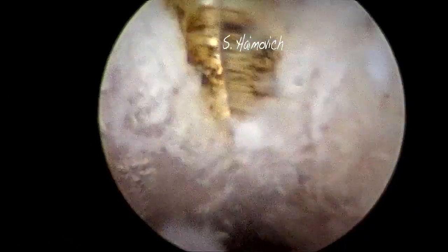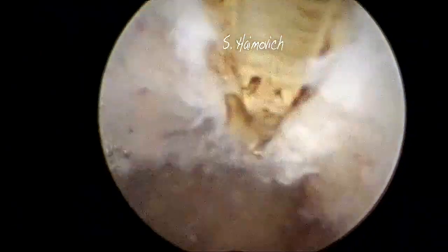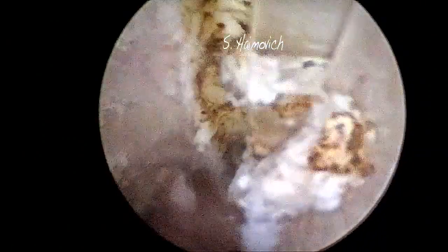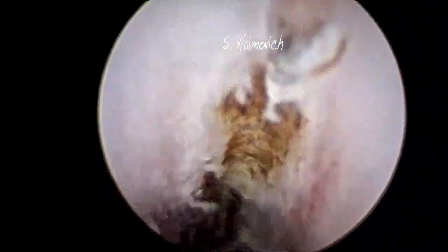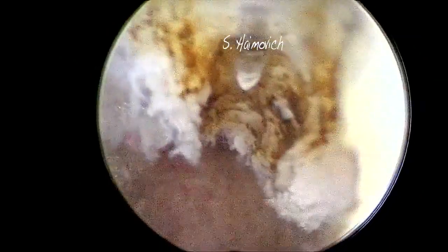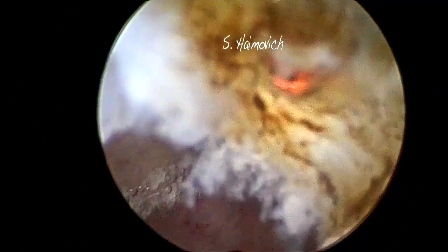For the correction we use diode laser. We apply a conical fiber with a wavelength of 1470 nanometers. The cut precision is 0.2 millimeters and the thermal damage is 0.5 to 1 millimeter. We cut from the internal os to the tubal ostium. The ultrasound gives us the distance to cut. The blue portion of the fiber has a diameter of 1 millimeter, which helps estimate the distance.